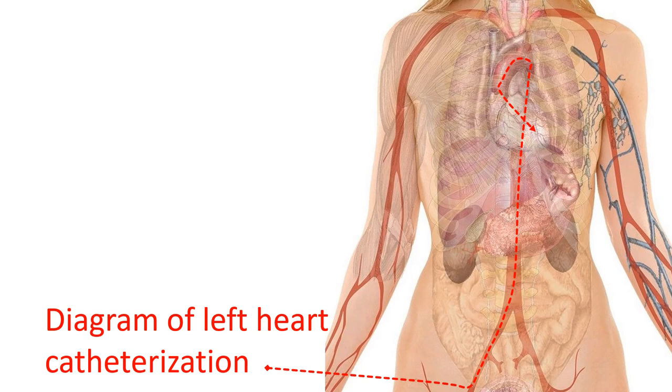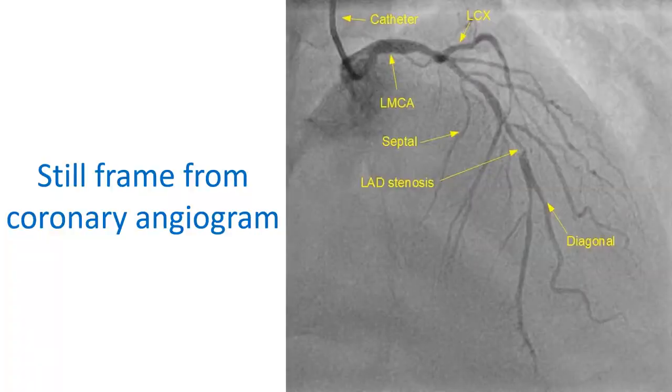Blood vessels in the groin, arm and neck are chosen for this study. In adults, the test can be done under local anesthesia. In children, as they are afraid of procedures, general anesthesia is needed. A related test known as angiography is also often done along with cardiac catheterization. Angiography is done by injecting radiocontrast medications into the blood vessels or chambers and taking continuous X-ray imaging, cine runs.